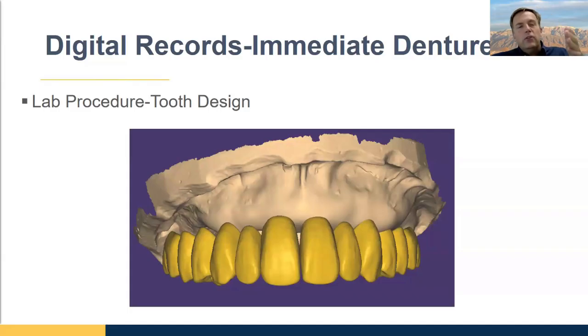There are special digital denture teeth that you can buy on cards that have kind of a bullet shaped, almost like an ovate pontic on the intaglio, and the software will punch an ideal hole for them. I don't really like those because if I use non-carded teeth, I can design them however I want, just like a crown and bridge case. So I can make them what I perceive to be perfect, which is nice.